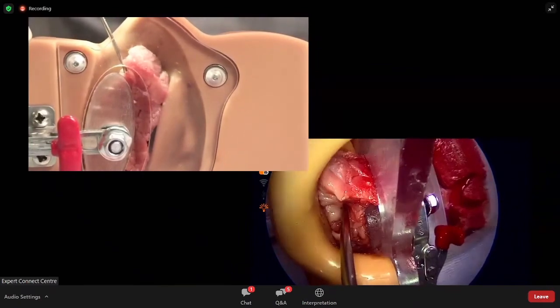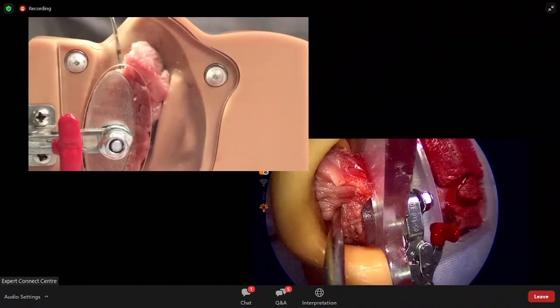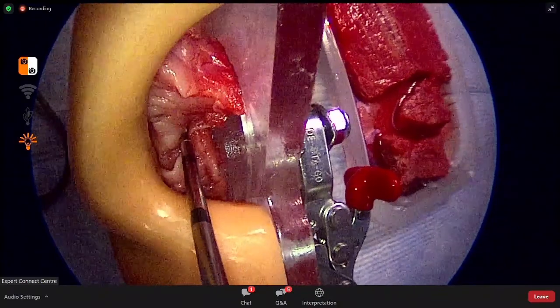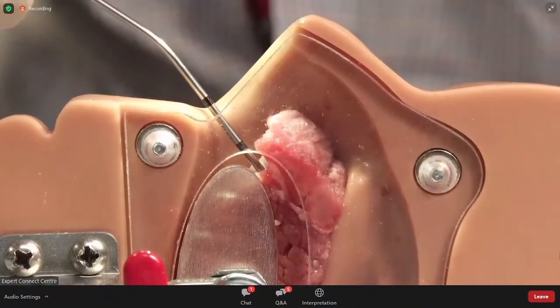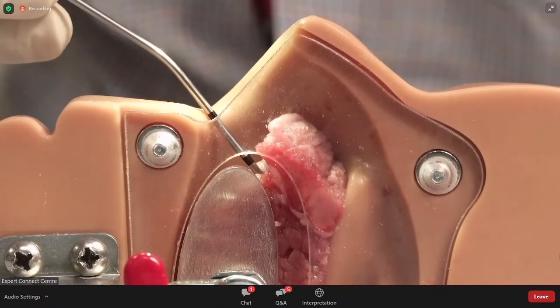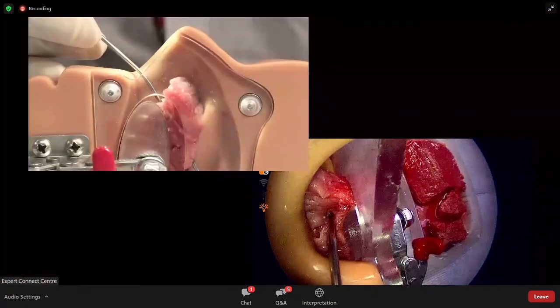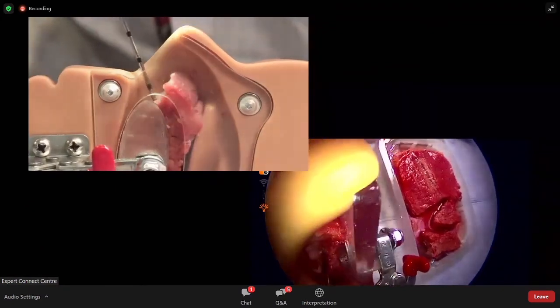Okay. So again, when you step on the ablate pedal, withdraw this slowly, and typically you will come to the end or to the tip of the instrument within 10 seconds. You can keep it in the incision point, and then you can make another channel, either superior or inferior depending on where you feel the mucosa is hypertrophic. Okay, so let's assume we're going to go superiorly there. And we're going to press the pedal and withdraw slowly again. And then one final pass.